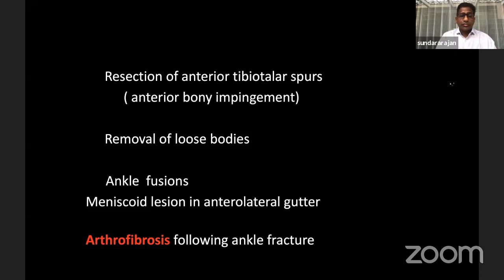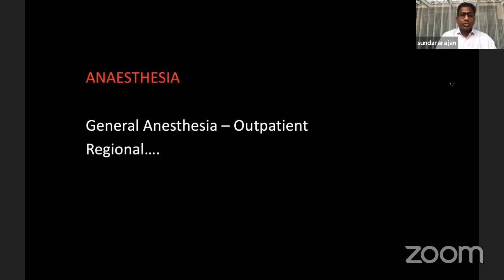It is a very good tool, and arthroscopy helps you, with minimal morbidity, to increase the ankle movements. What anesthesia to use? If you are doing a day case, you can use a general anesthesia. But in my experience, I use regional anesthesia because usually I discharge on the next day, to make the patient more comfortable.